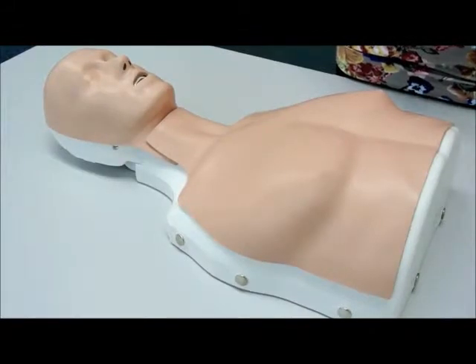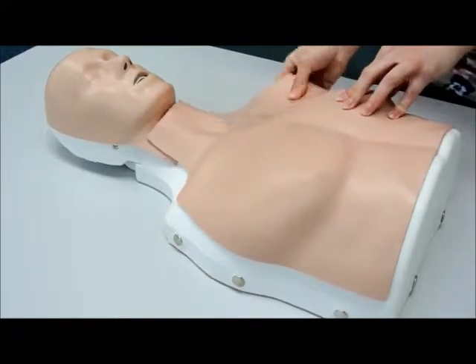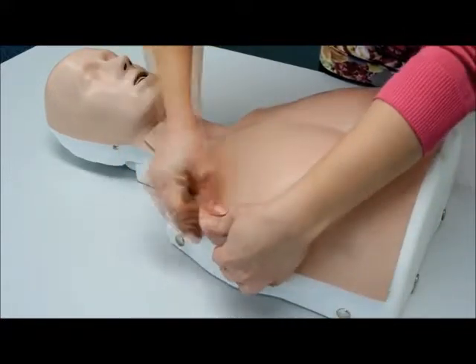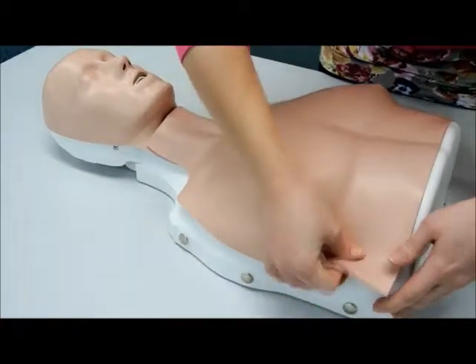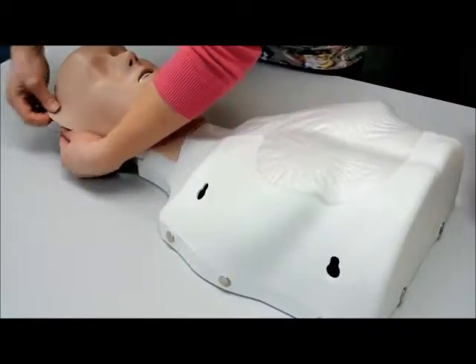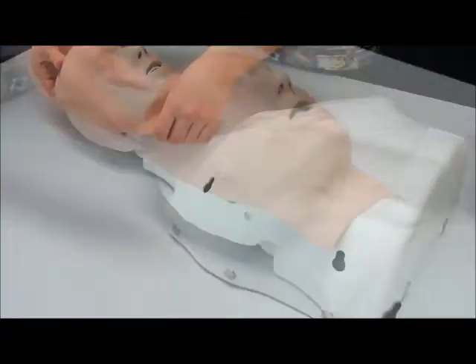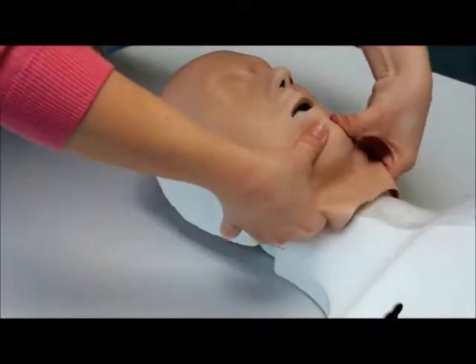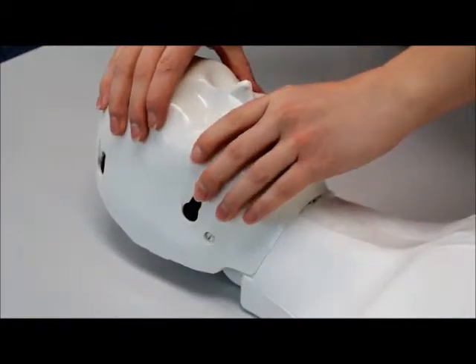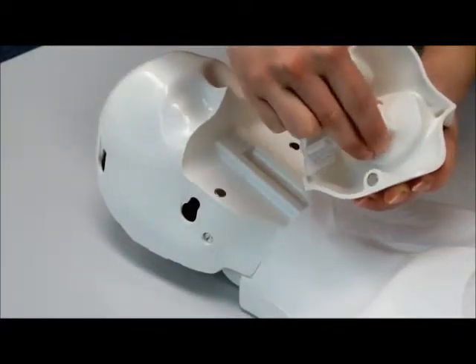The lung bags can easily be changed. First, remove the thorax skin. Second, remove the face skin. To detach the lung bag from the lung bag socket, you need to remove the jaw insert.